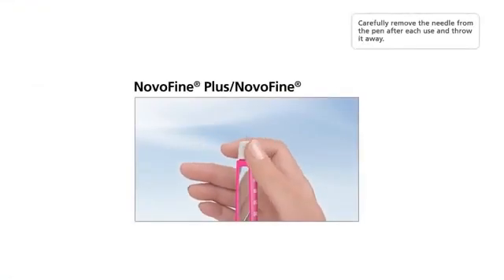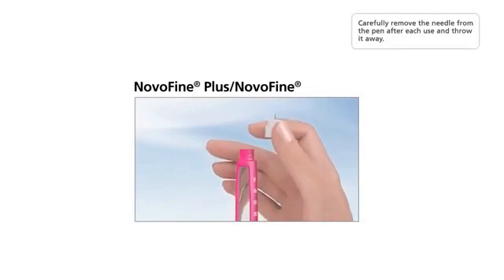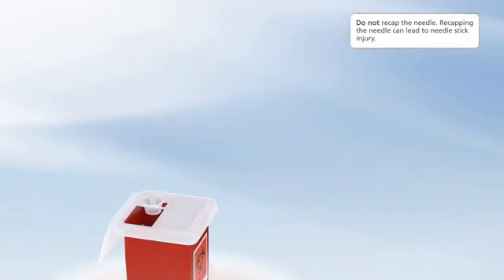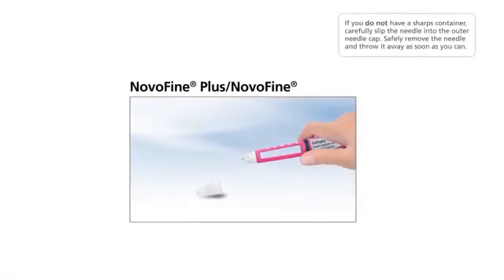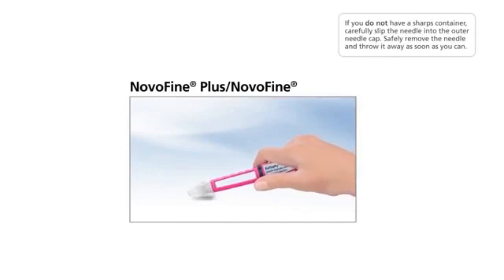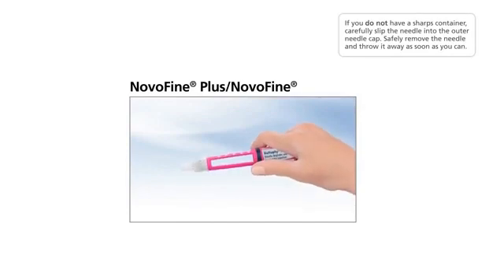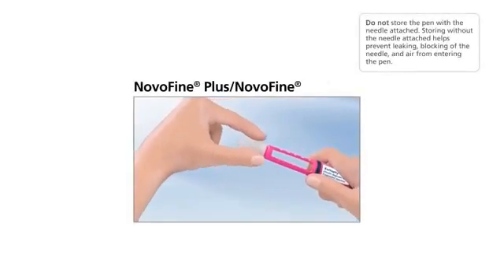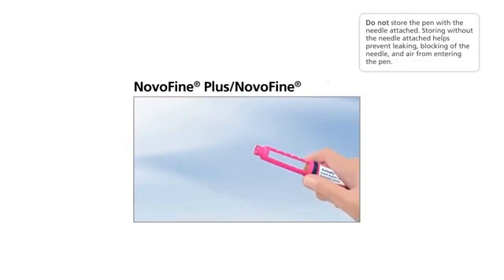Carefully remove the needle from the pen after each use and throw it away. Do not recap the needle — recapping can lead to needle stick injury. If you do not have a sharps container, carefully slip the needle into the outer needle cap, then safely remove the needle and throw it away as soon as you can. Do not store the pen with the needle attached, as storing without the needle helps prevent leaking, blocking of the needle, and air from entering the pen.